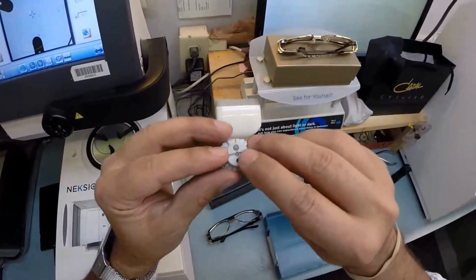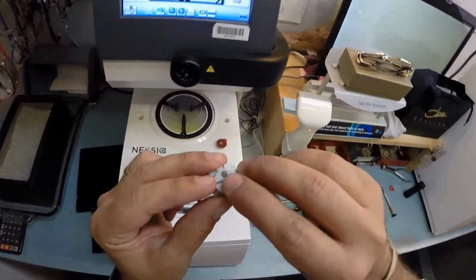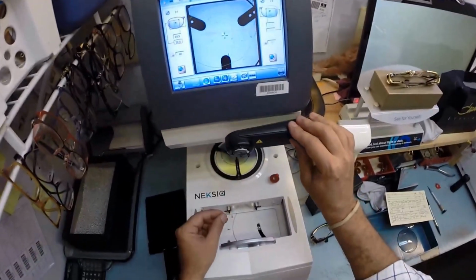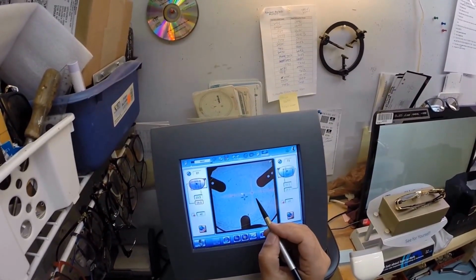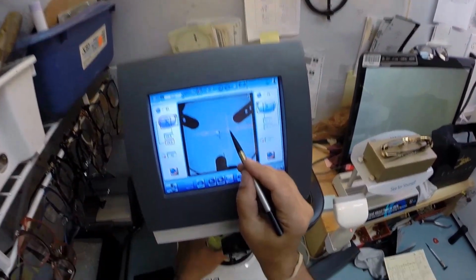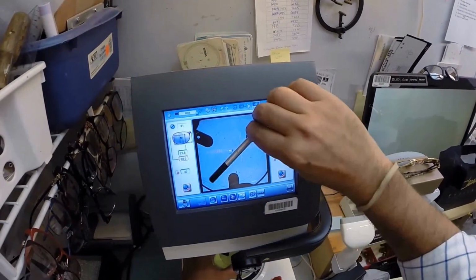Now on the back is a little silver button. That is a magnet. It's going to do its job twice tonight. The first time, it's going to attach itself to something magnetic here in the arm. This is what's going to swing down and place the block onto the lens. So I've got the dots on there, getting everything lined up. That cross there is the optical center. Those other 2 dots tell me it's lined up perfectly and it's not off kilter.